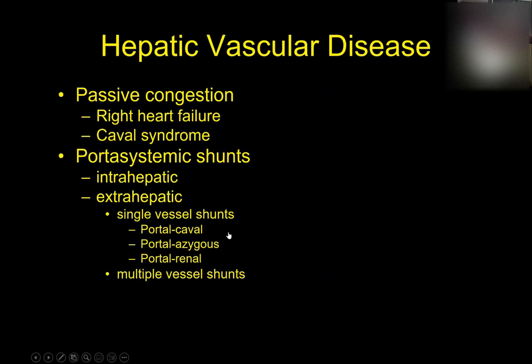Okay, so let's talk about some disease processes that can affect the vessels inside the liver.